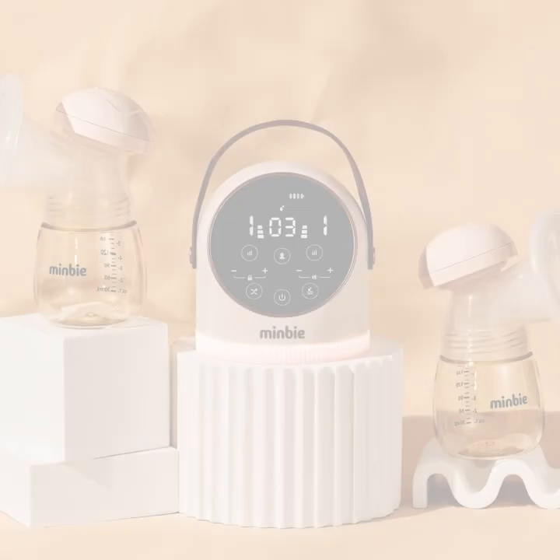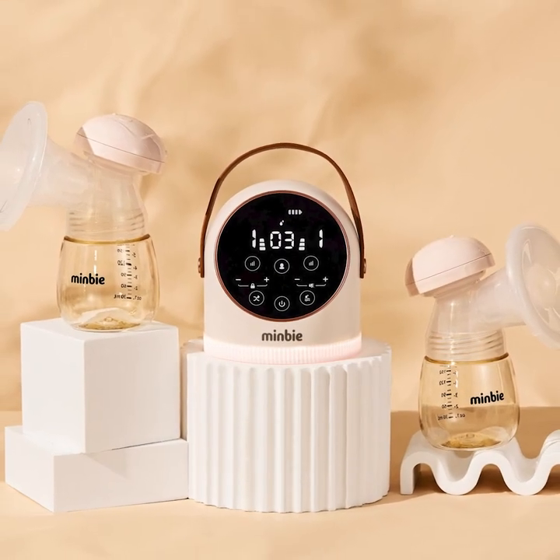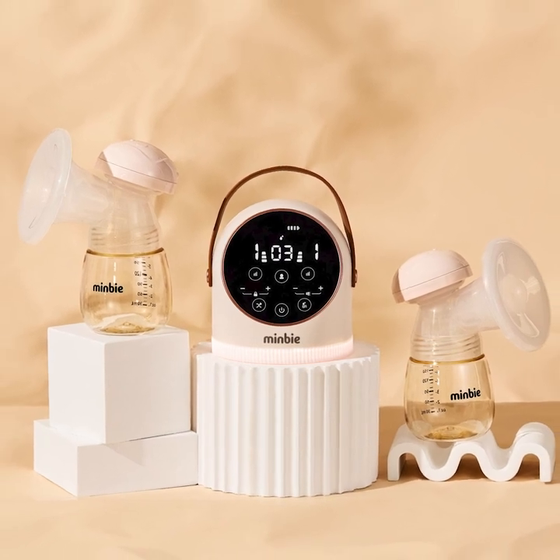The breast pump was super easy to use. The instructions are really straightforward and it's labelled really clearly, which makes things a lot easier. I love that it has these little lids so you have no spillage, because this is liquid gold and you do not want to lose it.